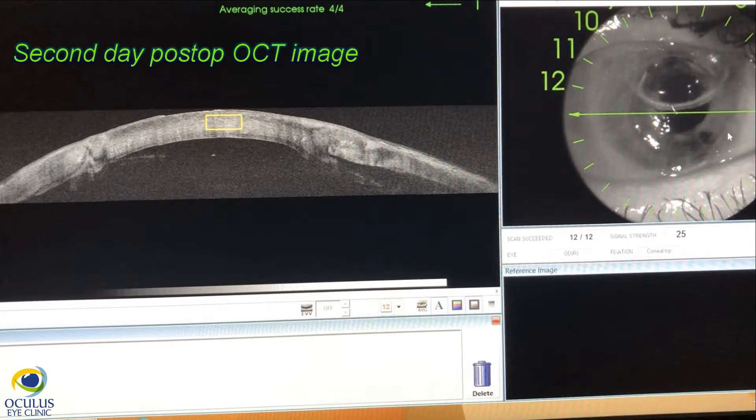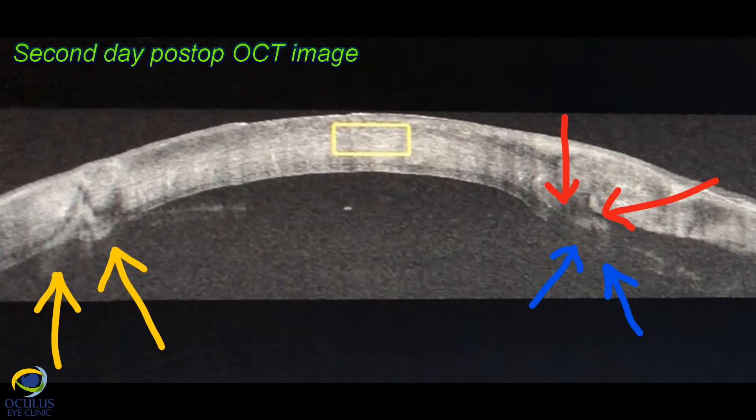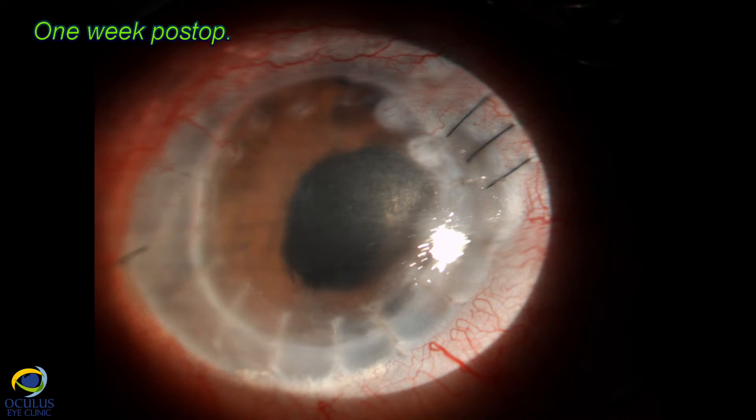This is the second post-op day — you notice the smaller air bubble. On the OCT you see a thin, nice lamella, and if you follow the red arrows, you can see the spur of the previous graft that I was talking about. The DSAEK lamella covers very nicely, all around 360 degrees, the host and previous PK junction.